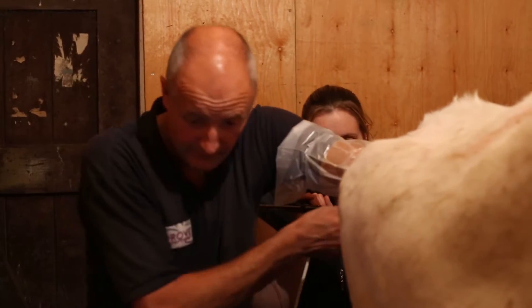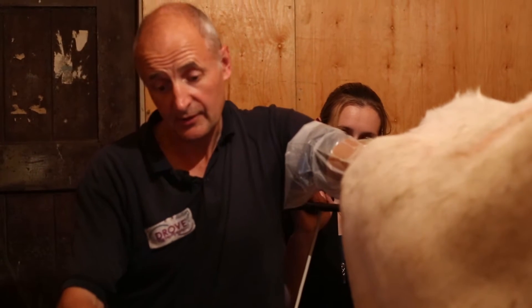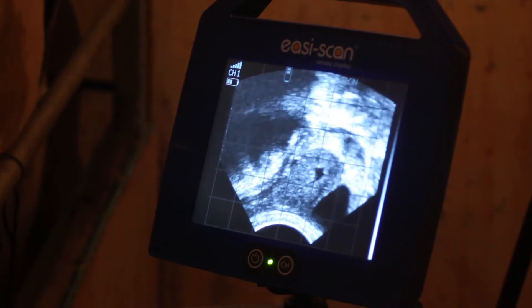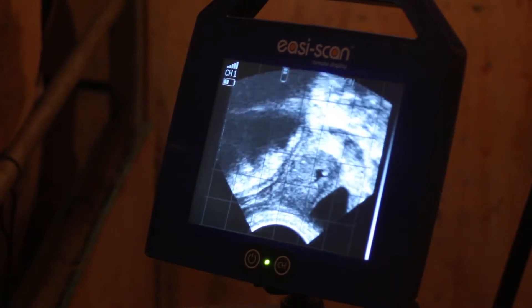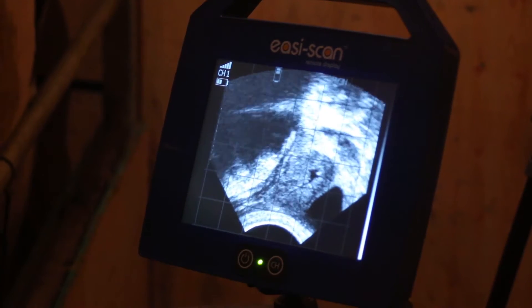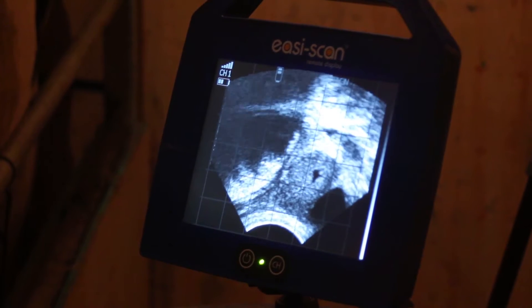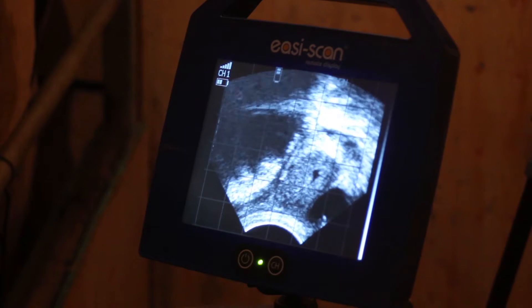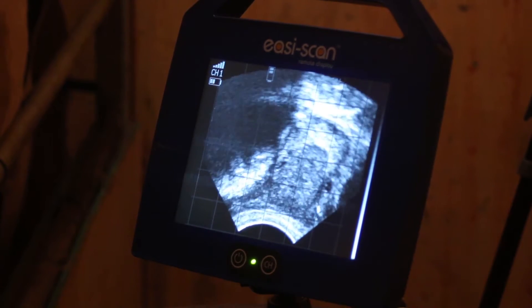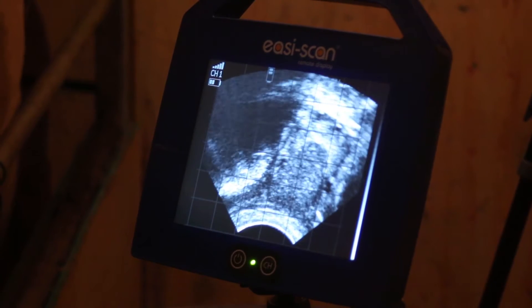I make sure the greatest diameter of the follicle is exactly where the needle will emerge. Starting the vacuum going, and now on camera behind me hopefully we'll be able to see the tip of the needle just emerging into the centre of the follicle. Here it comes and the follicular fluid collapsing as it gets sucked into the needle, down the tube and into the water bath. Hopefully we'll find that one later under the microscope.